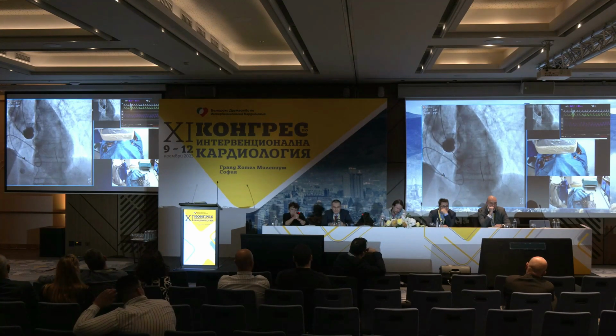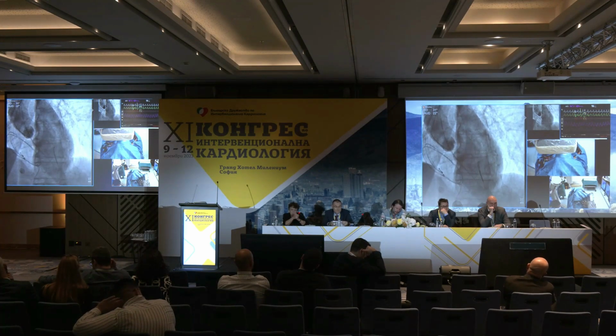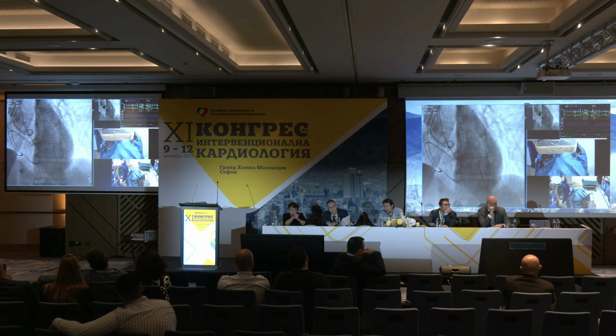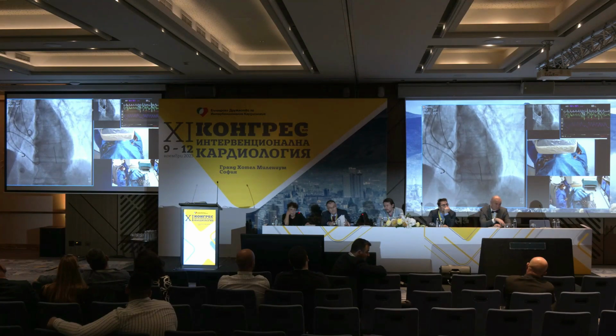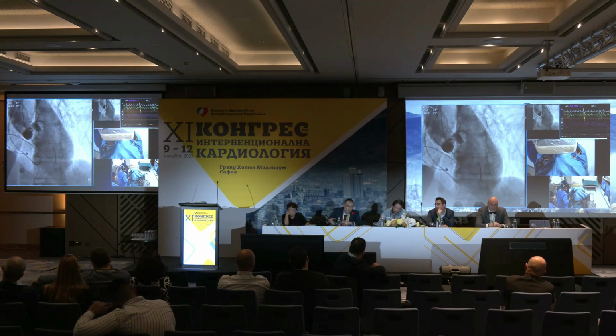But we have measured all the angulations and all the rest, and we have decided that it's possible. By the way, the live view is showing that the aorta is not so short, and you see it's not so horizontal. It's slightly horizontal, but it's definitely possible. It's not off-label, so the implantation of Evolut is not off-label. Okay, and we advance it. We are going to proceed.